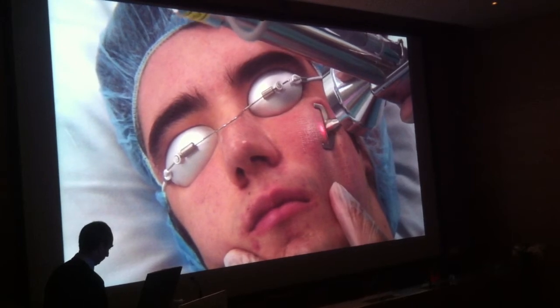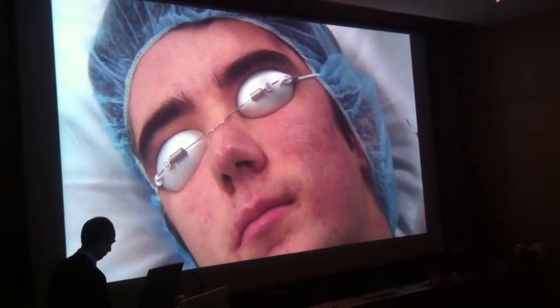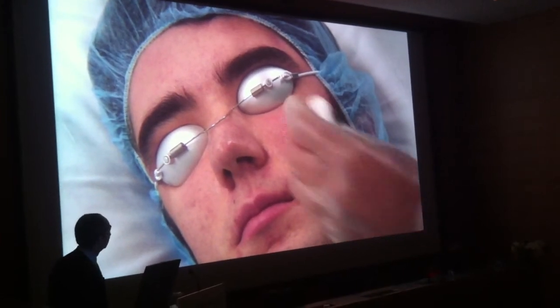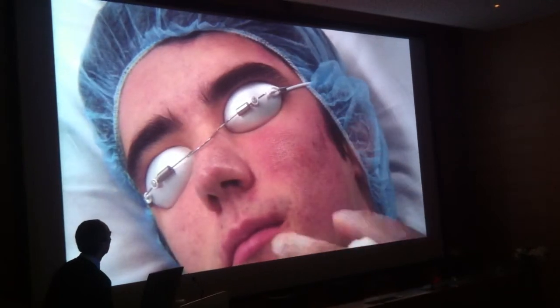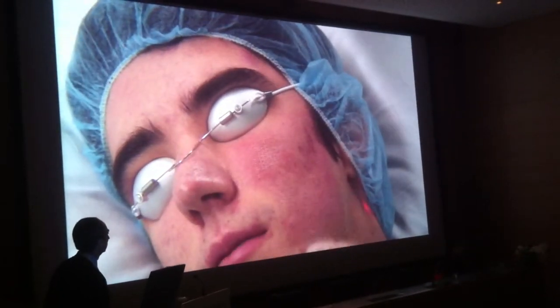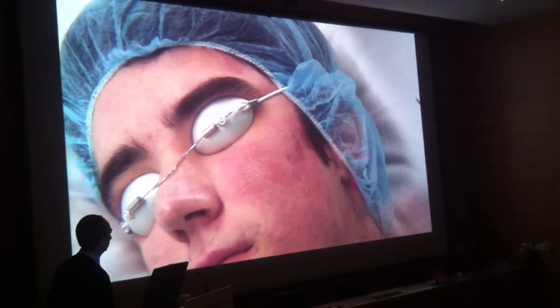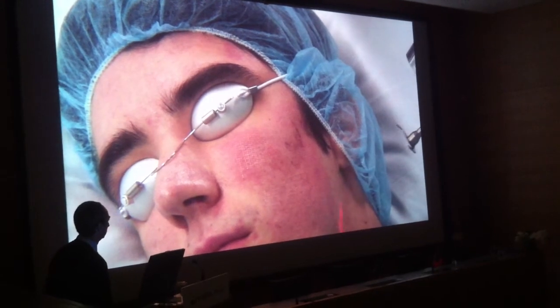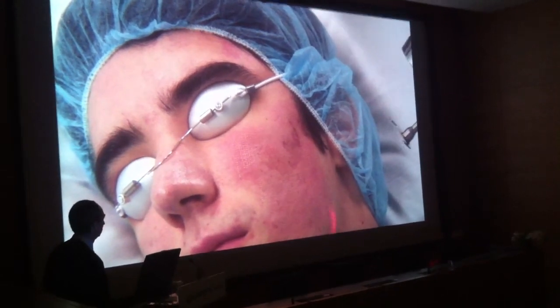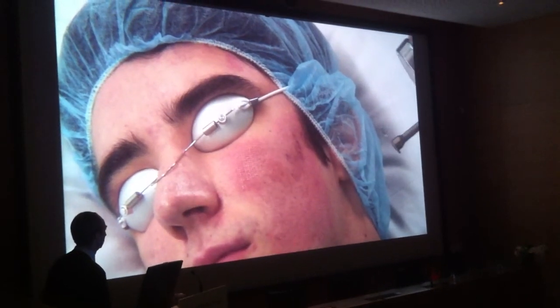Sorry for repeating myself, but that's my main message. We should promote regeneration, and the little holes that we can make, if we have a good coagulative power behind them, can deliver enough heat to the surface without impairing skin integrity, just stimulating regeneration and remodeling. Of course, you have to wait longer for that, but I think this is the way it should be done.